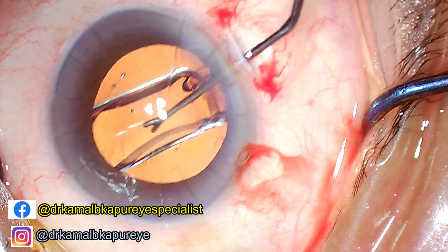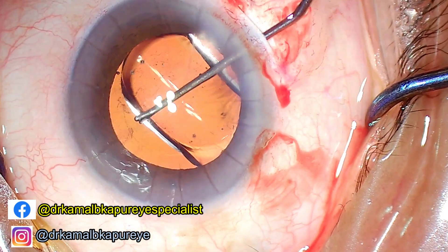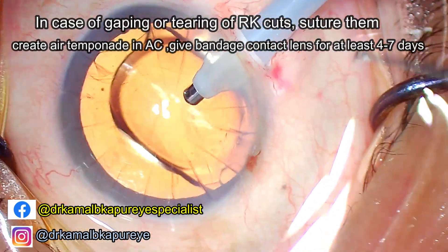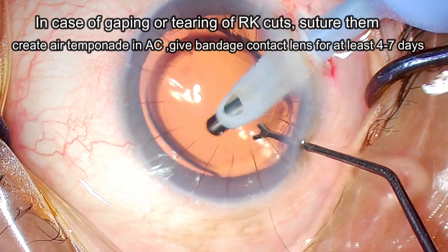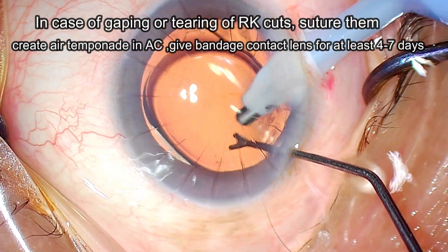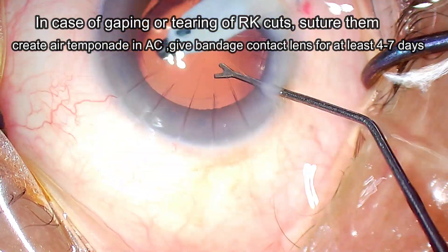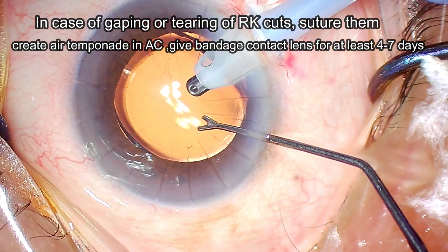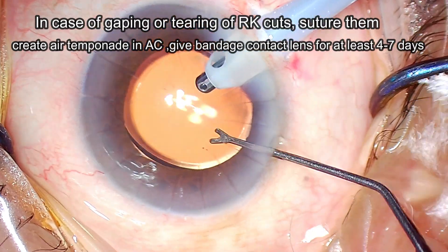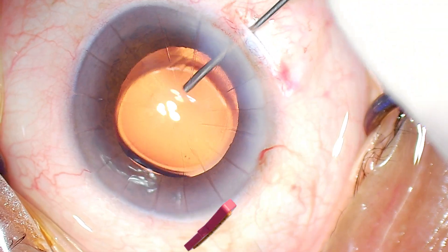Once the IOL is inserted inside the eye, we always try to place the IOL haptic-optic junction at 30 degrees on the temporal side. In my opinion, I have noticed this reduces negative dysphotopsia, especially in patients who have very deep anterior chambers. This patient is a high myope, so I am placing the haptic-optic junction of the IOL at 30 degrees so that this junction stops light rays entering from the temporal side into the IOL.